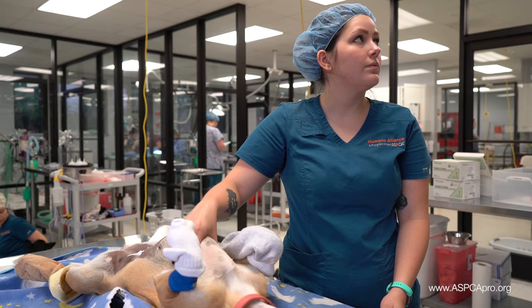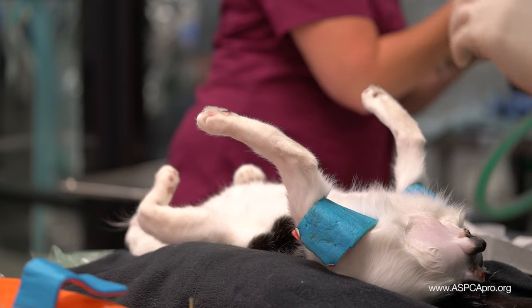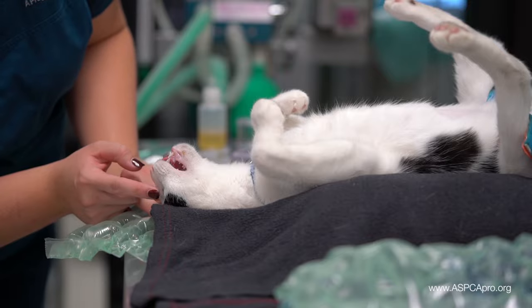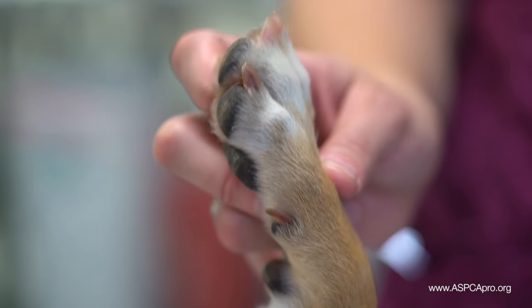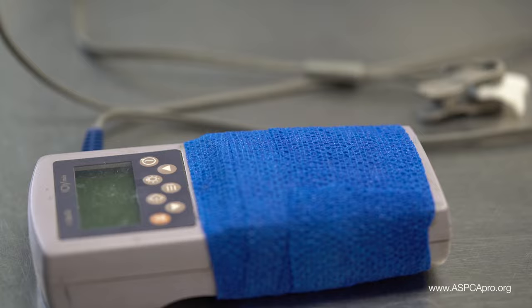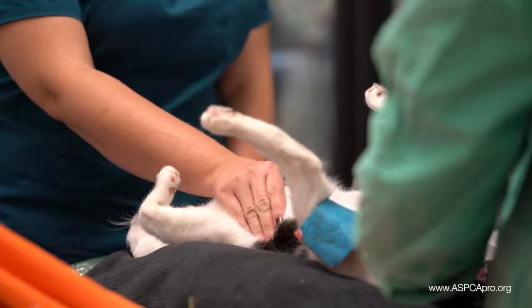Animals under general anesthesia should be closely monitored to assess anesthetic depth. Our goal is to have them at a surgical plane of anesthesia with no spontaneous or reflexive movement in response to surgical stimulation. Close anesthetic observation also plays a critical role in the prevention of anesthesia-induced cardiopulmonary arrest. Monitoring equipment can be used to aid in the assessment of anesthetic depth, but there is no substitute for proficient hands-on monitoring.